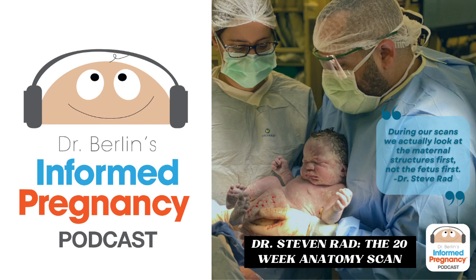When ultrasounds are taking a long time, well, from the get-go, we offer breaks. We explain to them to let us know if anything feels uncomfortable, or if we're pushing too hard. If they need a break, water, a snack, a bathroom break. And we're constantly asking, how are you doing? Do you need a break, etc. Sometimes we'll take what we call an intermission once or twice, especially if the baby is not moving. And so they can go buy snacks. Yeah, we have snacks in the office. We bring them snacks and water, and they go to the bathroom. They walk around a little bit, and we start again.